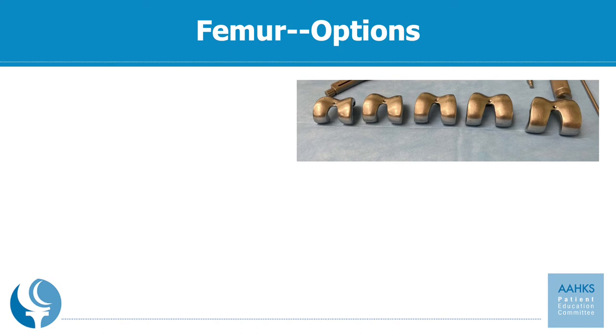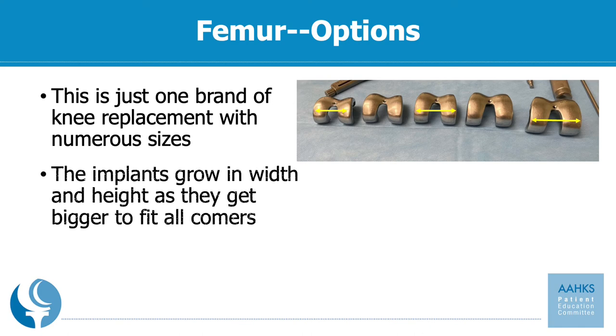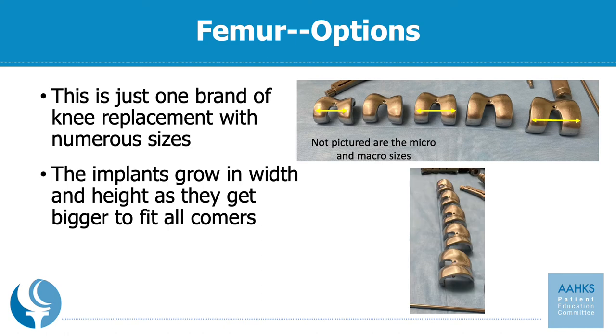One size does not fit all. Pictured here is just one brand of knee replacement with numerous sizes. You can see that the width of the implant grows as the size gets bigger. This is just five of the sizes available for this one company for the femur, and there are also macro and micro sizes which include two to four more implant sizes just for the femur. The implants also grow in width and height as they get bigger, giving us tremendous versatility during surgery to make sure you get the right implant for you.